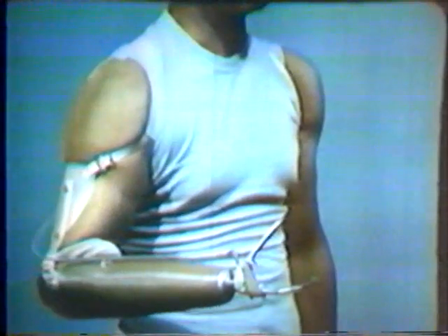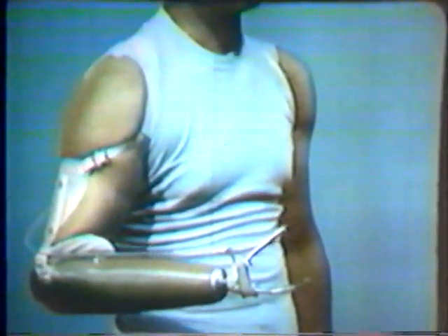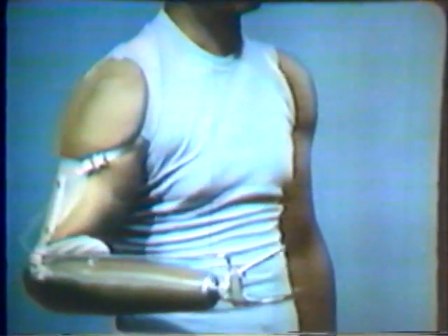Notice that here the amputee uses biscapular abduction as the prime body control motion when it is desirable to open and close the terminal device while working with the prosthesis close to the body. In this position, shoulder flexion cannot be used and scapular thoracic motion is substituted in order to operate the terminal device.